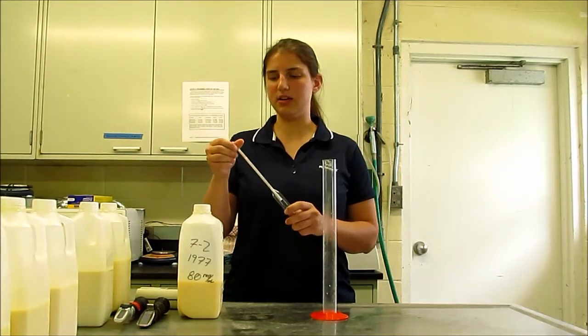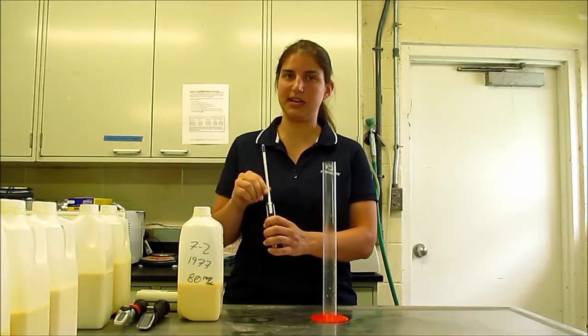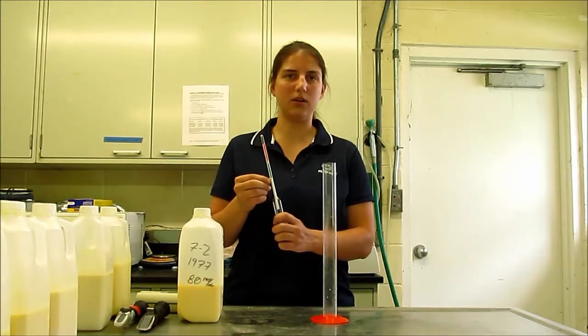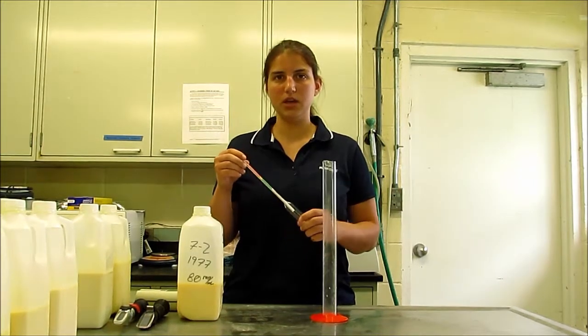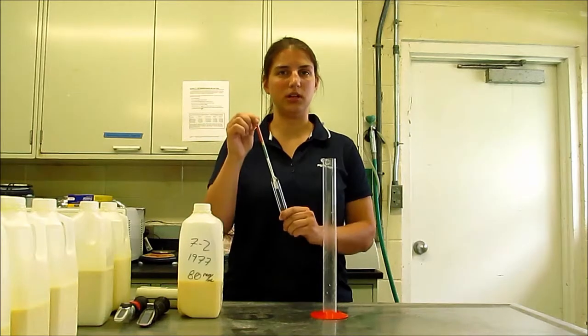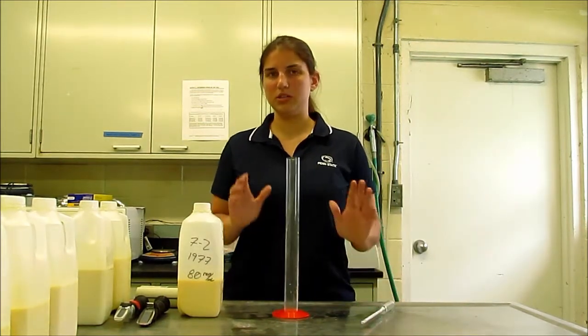It has a scale on it that will relate the colostrum density to the IgG concentration and give you an exact value. It also has a color-coordinated scale, with the green being high-quality colostrum and the red being poor-quality colostrum. These come in multiple different models, but all of them will come with a colostrometer and a cylinder for measuring the colostrum quality.